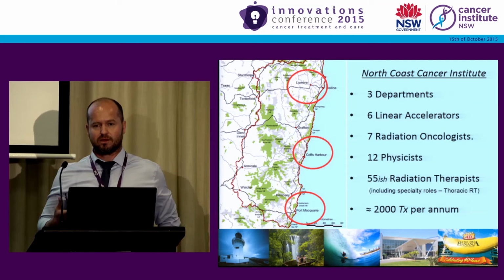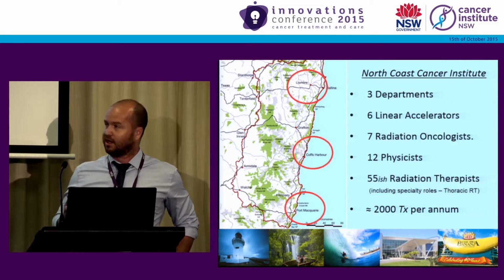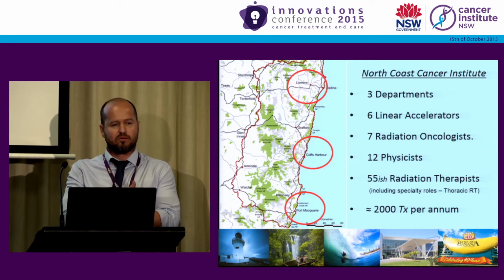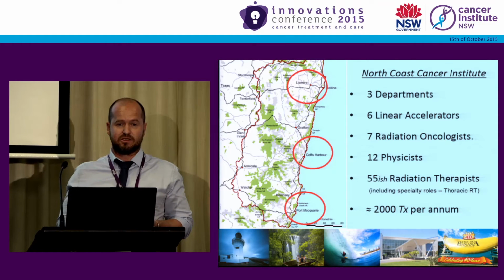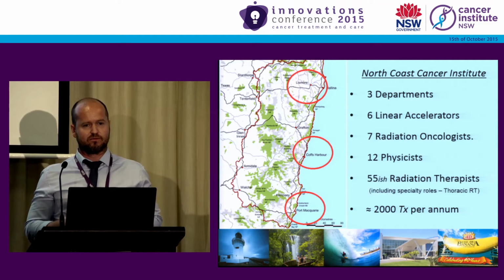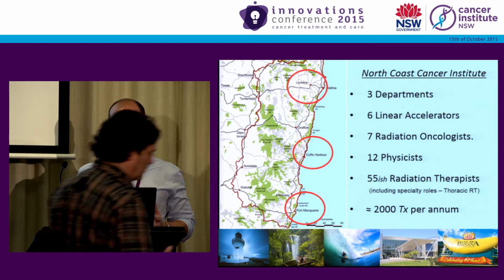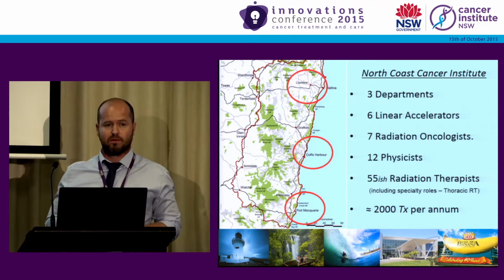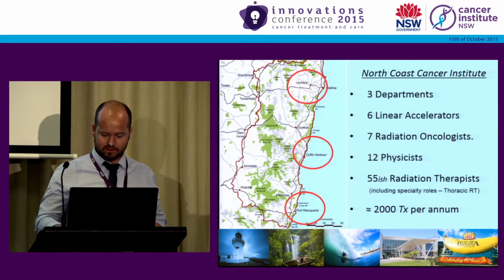I'm employed by the ROs at Port Macquarie to concentrate on thoracic RT, which, as you may be aware, has rapidly changed probably in the last 10 years or so, primarily on the back of developing advanced technology, one of those innovations being 4-dimensional imaging to account for the effects of respiratory motion better in lung tumours. So this has really been a collaborative process across the 3 sites and really provided a platform for us to actually dramatically improve how we treat lung cancer on the North Coast.